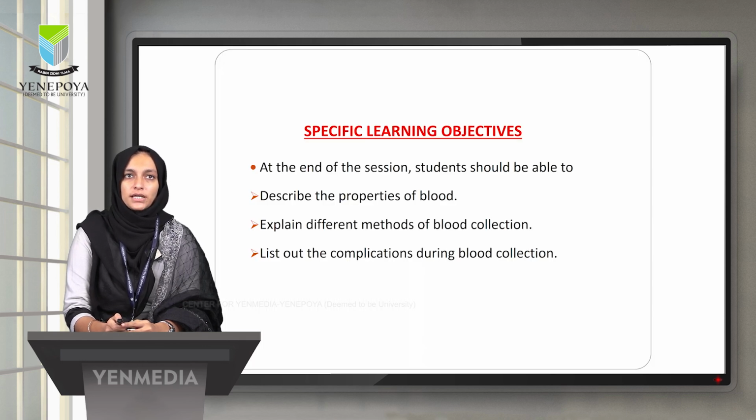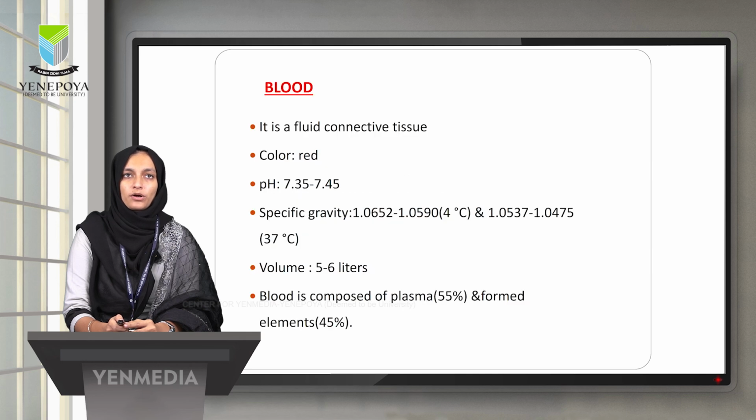I am going to talk about the topic blood collection techniques. At the end of the session, students should be able to describe the properties of blood, explain various methods of blood collection, and list out the complications during blood collection. First, we'll move on to an introduction about blood components.